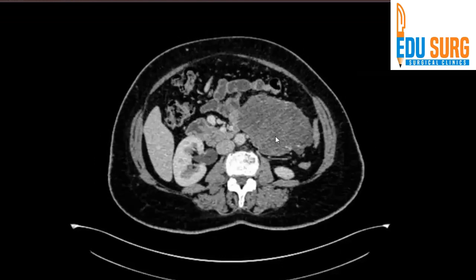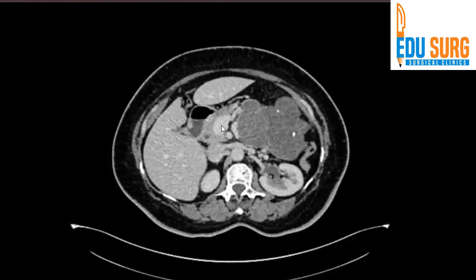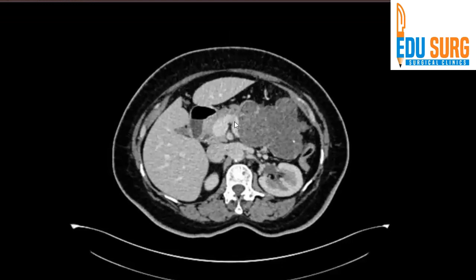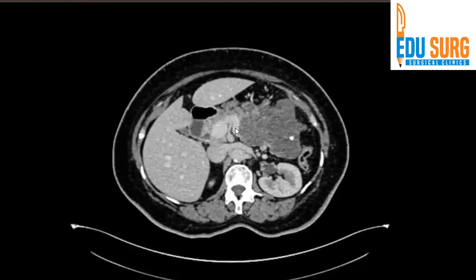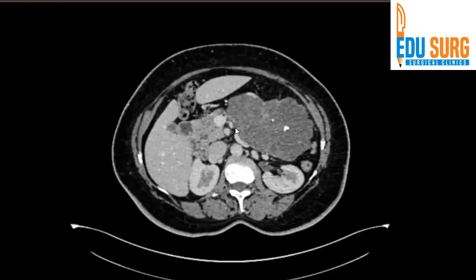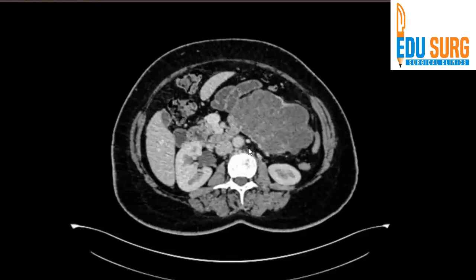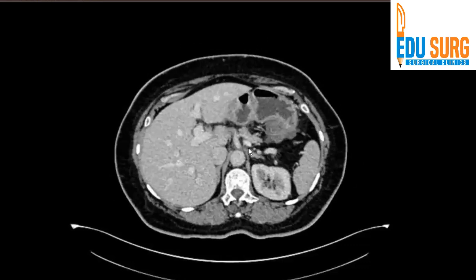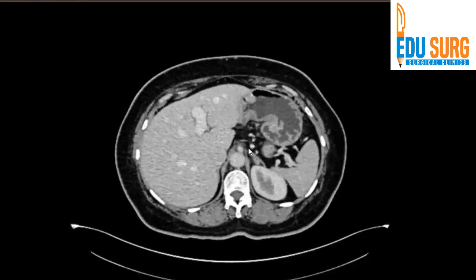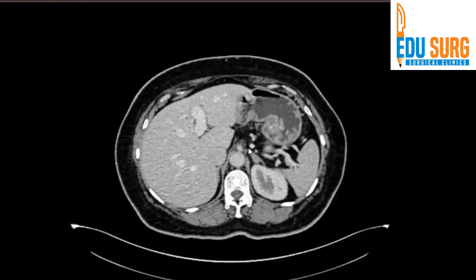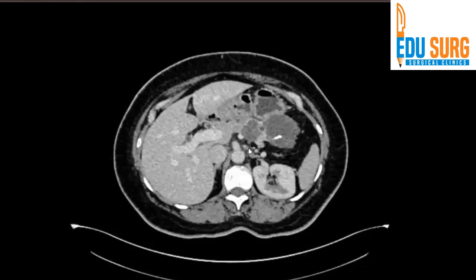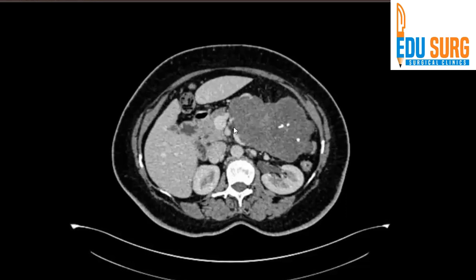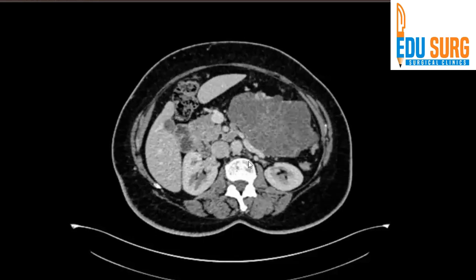There is a hypodense lesion. This is the portal phase — you can see the portal vein and the superior mesenteric vein, with the intrahepatic portal vein going down. This is the splenic vein. It is very important in this patient to trace the entire splenic vein, because if the splenic vein is involved by the tumor, we cannot do a spleen-preserving distal pancreatectomy with vessel preservation, which is known as the Kimura procedure. So, this patient would need a Warshaw procedure if the splenic vein is involved.